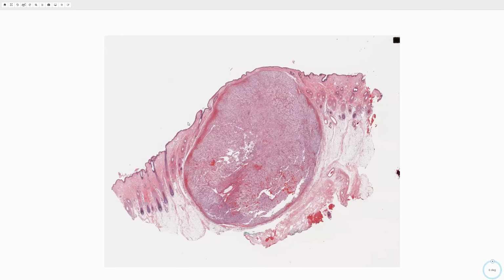Moving on to our next metastatic lesion, from low power, you can see that we're in a hair-bearing area with mature terminal follicles, so large kind of normal size follicles. We have a very nice excision here, and this is typical of this site of this metastasis. From low power, I think you can also appreciate that there's quite a bit of hemorrhage. So this is a bloody and kind of clear cell lesion that is typically seen as a metastasis in the head or neck.